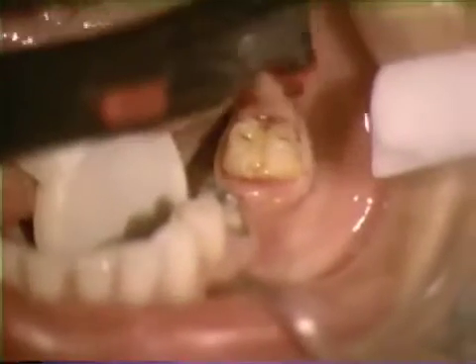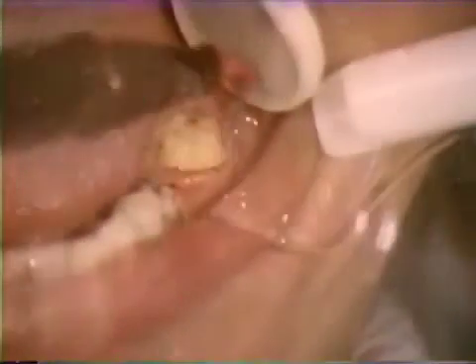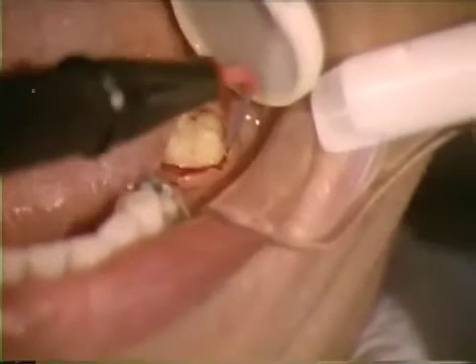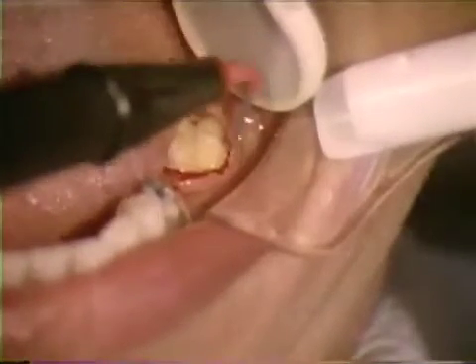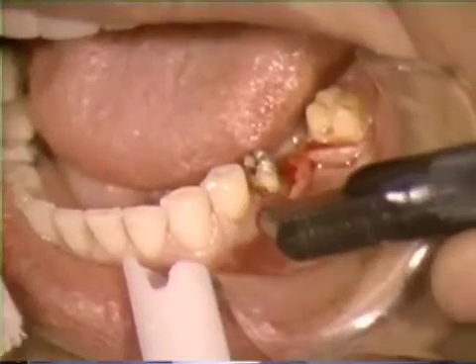Electrosurgery relies upon electrically generated energy from high-frequency alternating currents to cut or alter tissue. This method differs from the mechanical cut produced by a scalpel. An electrosurgical probe becomes a thermal knife comparable to the plasma scalpel, laser instrument, or cryosurgical tip.